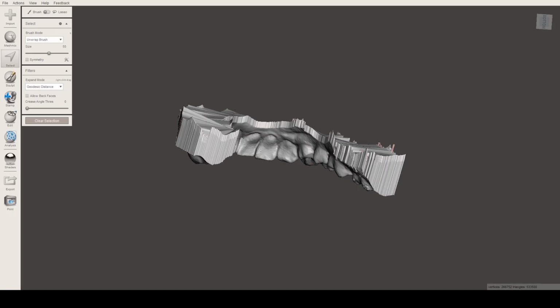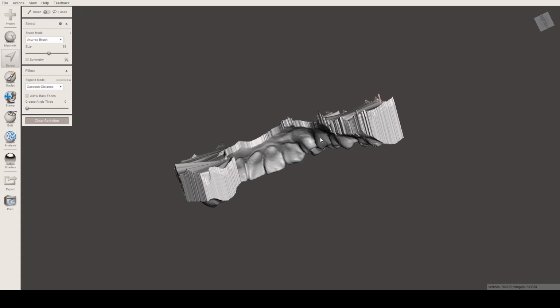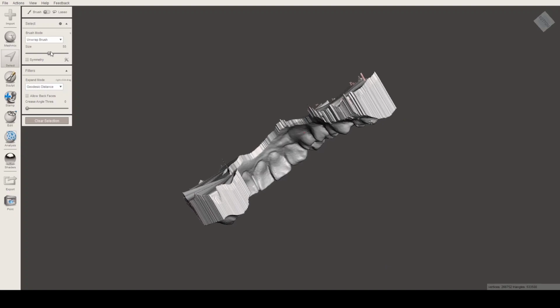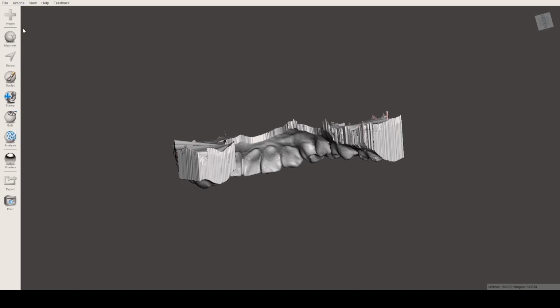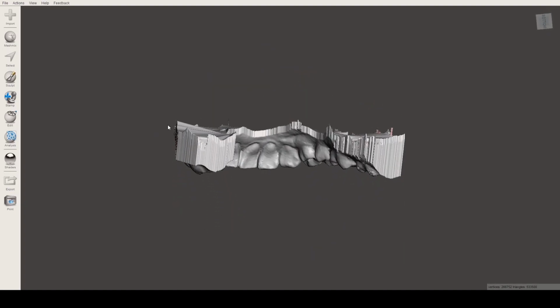Now that we have imported a 3D model, we can manipulate it and start working with it. As you can see in our user interface, we have a bunch of options. Let's deselect this. We have a bunch of UI buttons on the left side of your screen, and this whole thing is a toolbar. It's where your tools are, just to be more organized, because you don't want to be messing around looking for other buttons.